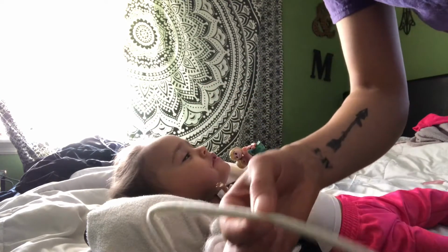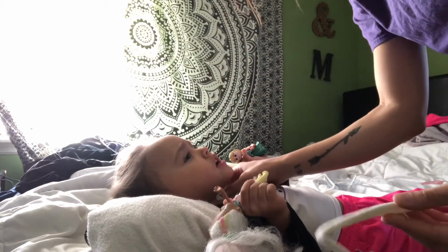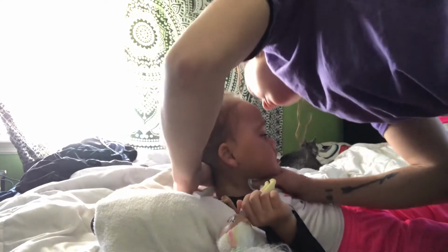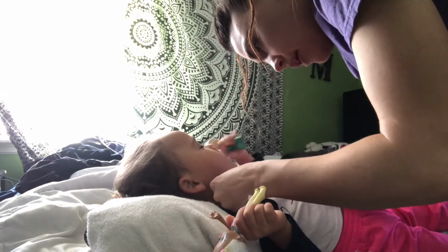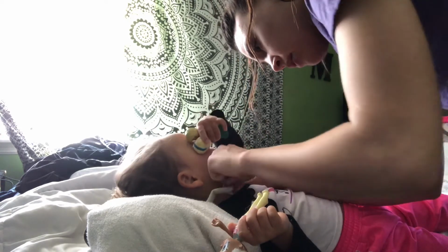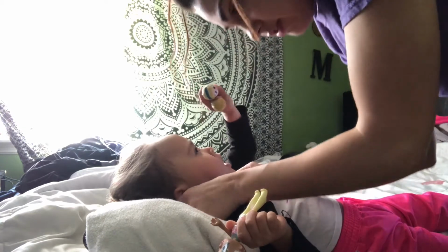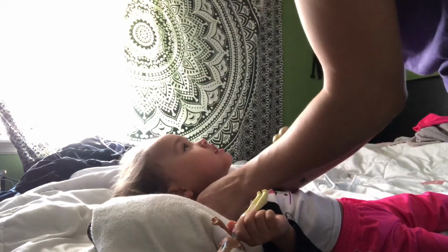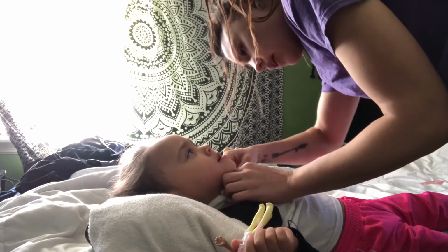So this is how I do it, just because there's a lot of powder on it. I hold in the trach on both sides. Sit up a little bit. Now that she's older, I can do this. And go from the back to the front. I already have the gauze in place, so now I'm just connecting them enough so it's holding the trach in place. No, hold on, look at mom. Look at me. Good job.